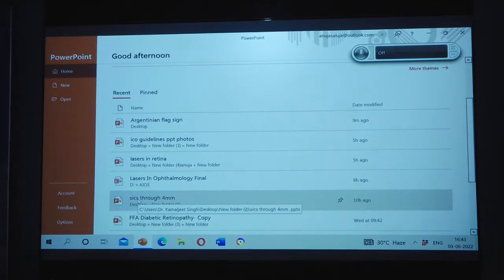So you can make a superotemporal incision for the right eye or superonasal for the left, and in most cases you would be correcting the astigmatism. You can take advantage of the surgically induced astigmatism that is there with small incision cataract surgery. So you can make it astigmatic when you would like to. Thank you, sir.